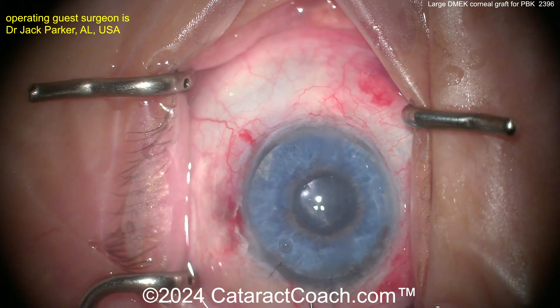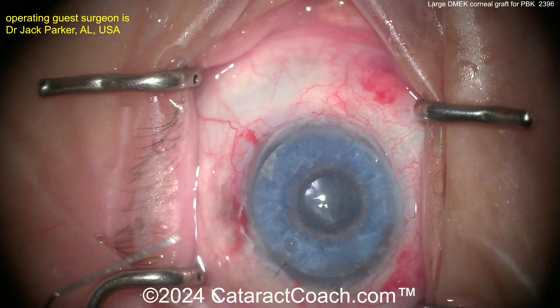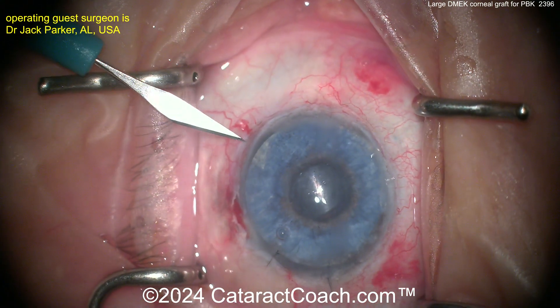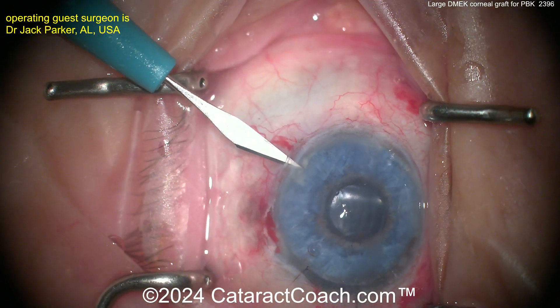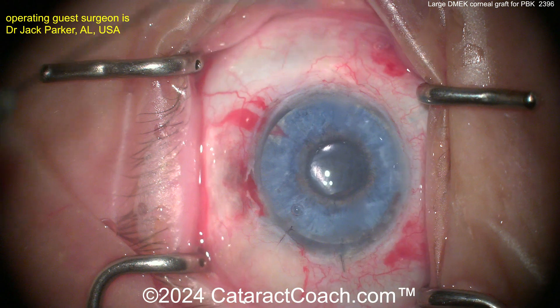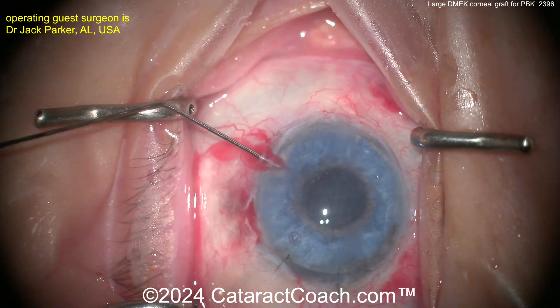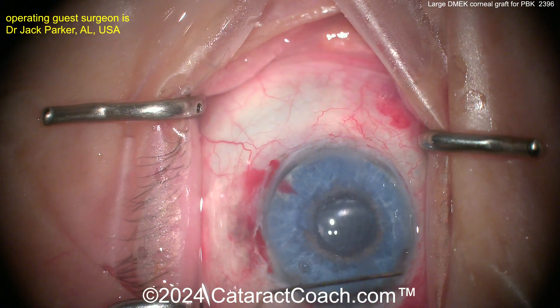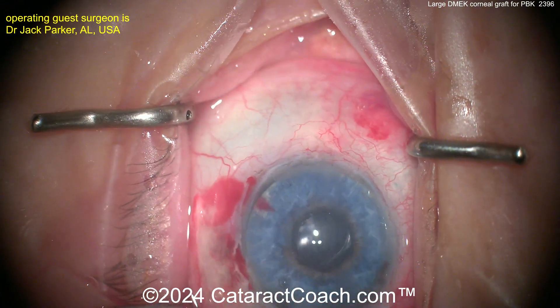I've done some DMEK surgery and taught some residents some DMEK surgery, but nothing compared to this level — this is truly outstanding surgery. Now let's see a little pair of needles, maybe to get that one corner. This is tough because with a large diameter graft, it's kind of hard to sneak under it. Trying here — maybe a different angle, maybe even more posterior.